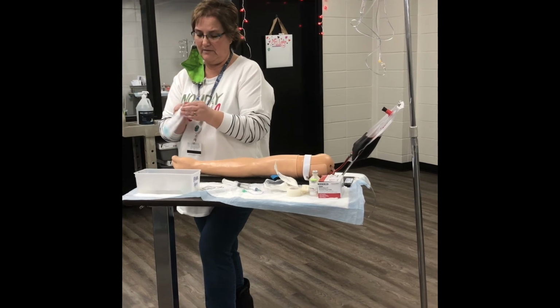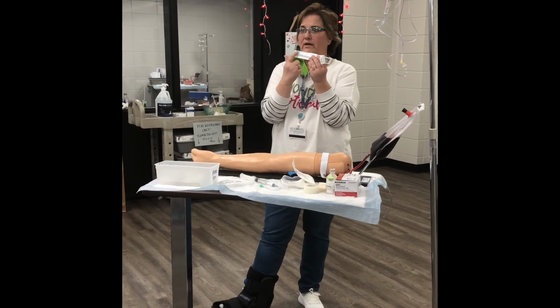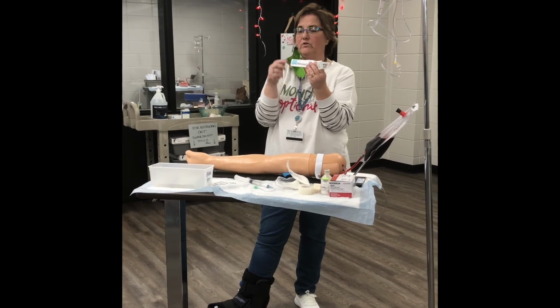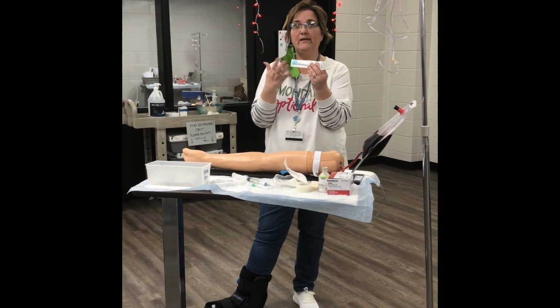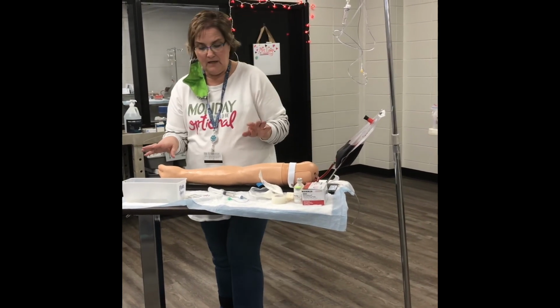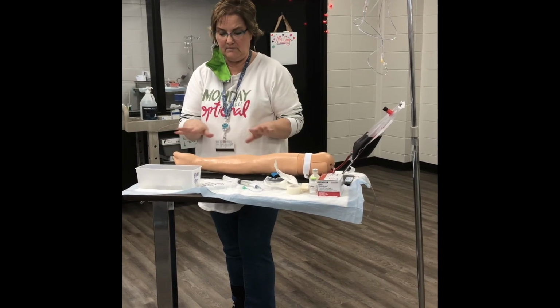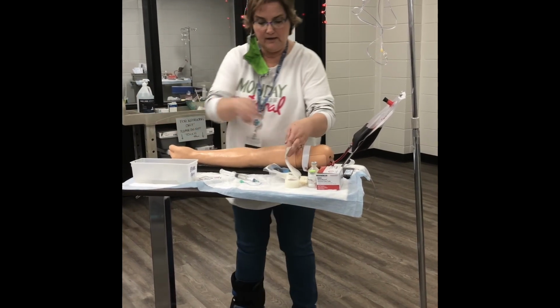All right, so I'm going to go ahead and open this. Now, the size and gauge of your needle is on here, and you're going to need that when you chart. So if you don't know what it is, hold on to this piece of paper. You can chart later. All right, once you've got this ready, your site is clean, I think you're ready to go.